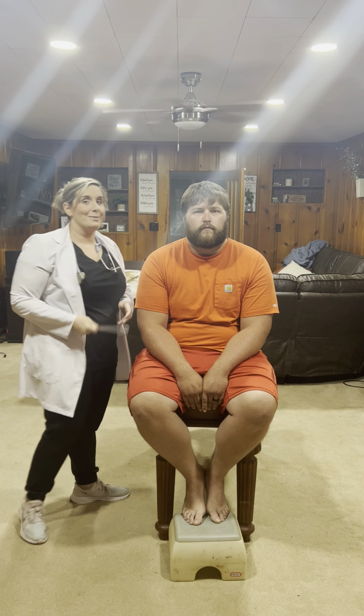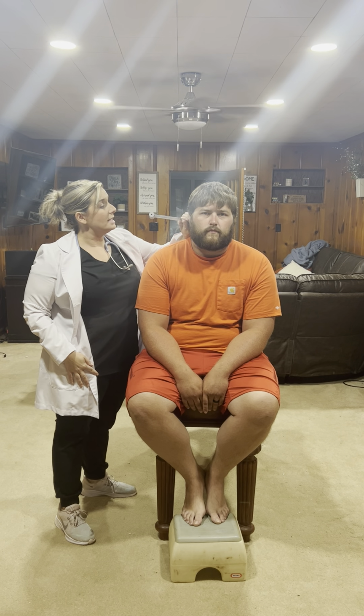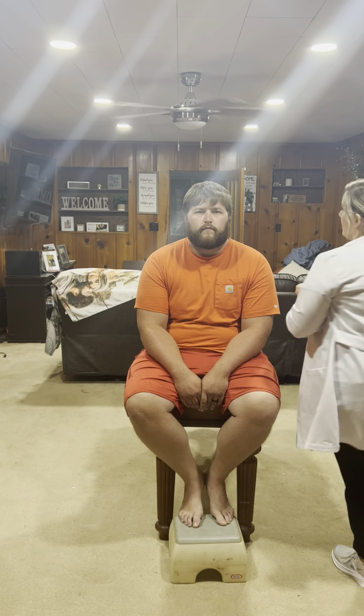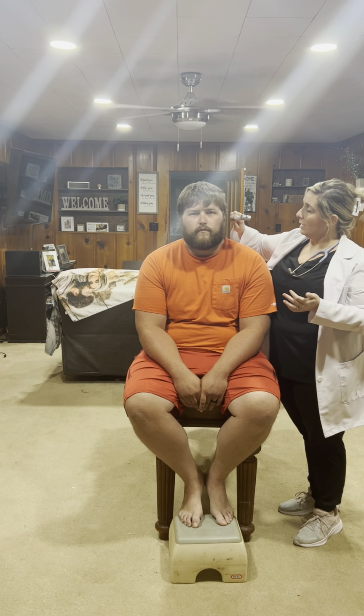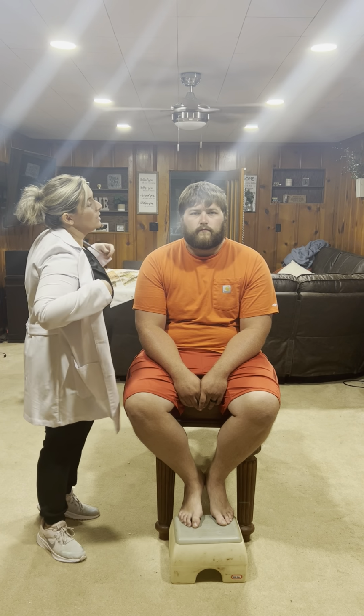Yes. All right, I will do the Rinne test. I'm going to ignite my tuning fork, and let me know if I'm going to put it on the mastoid process if you hear that and yes. Still hear it. Okay, I'm going to do that on the other side. Yes. And now? Yes. Okay. All right. So we were testing to make sure that air conduction is greater than bone conduction.